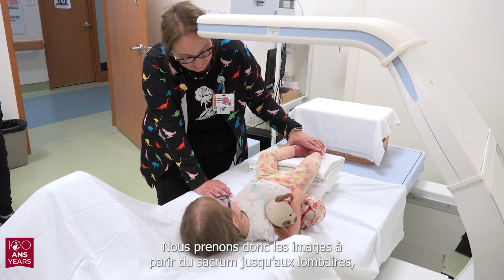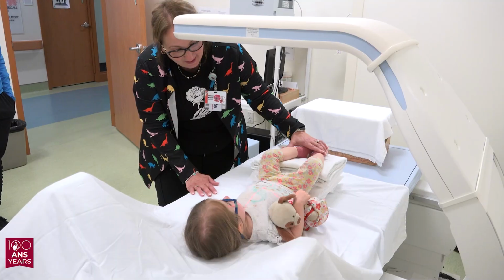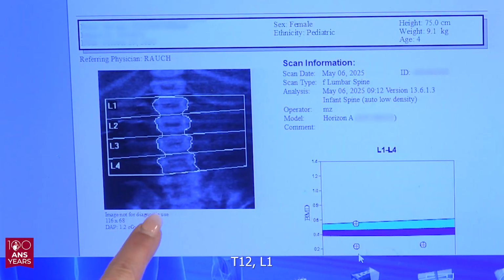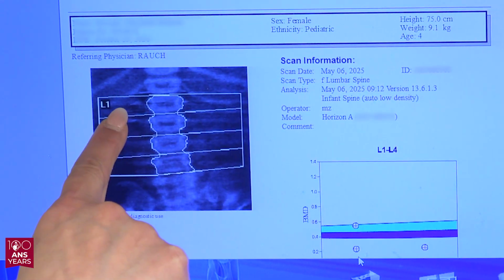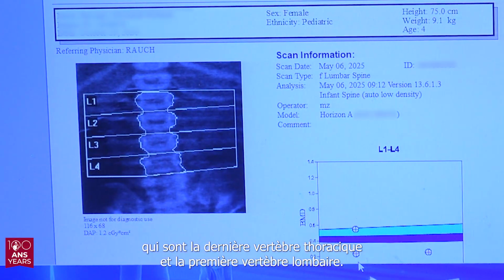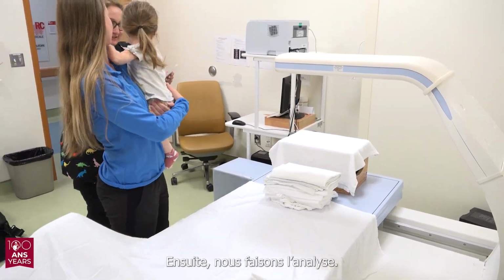So we take the images from the sacral area all the way up to the lumbar, and we stop when we see T12 L1, which is the last thoracic vertebrae and the first lumbar vertebrae. Once the exam is done, the patient is able to step off and we do the analysis after.